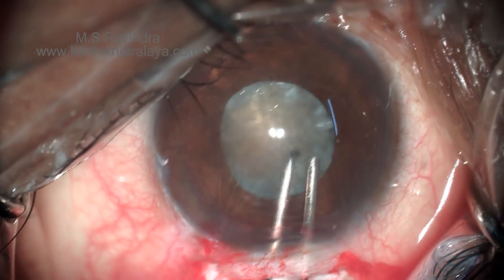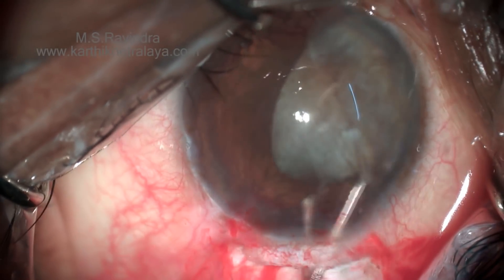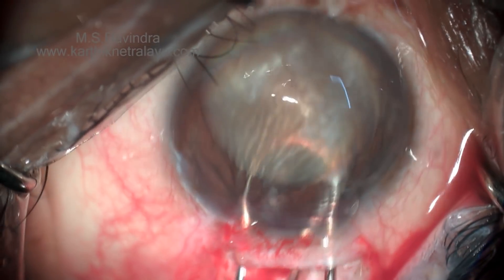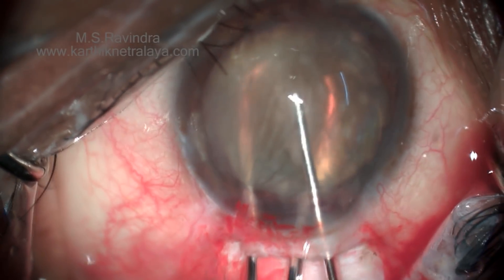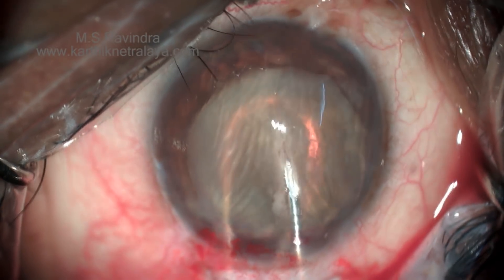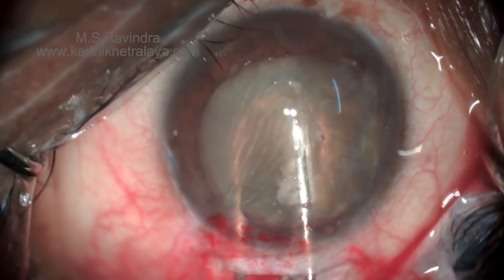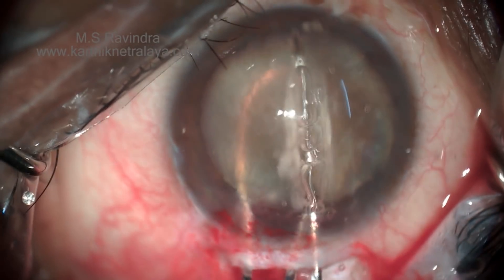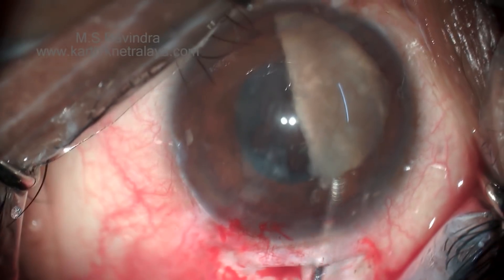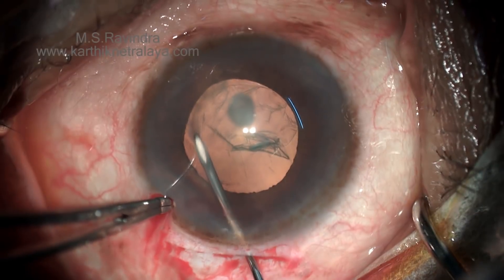Rotate the nucleus and ensure that the complete nucleus is in the anterior chamber, then bisect the nucleus. The cystitome, mounted on a 2 ml visco syringe with continuous injection, is used to bisect this very hard nucleus — it needs many attempts to score and cut it into two halves. Always ensure that the two hemi-nuclear pieces are totally separated before removing the first one; otherwise the second piece will start moving and damage the capsule.